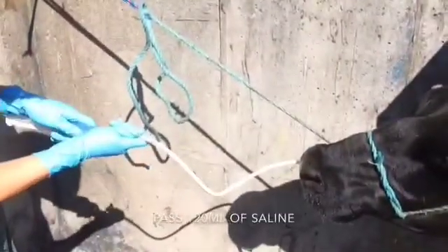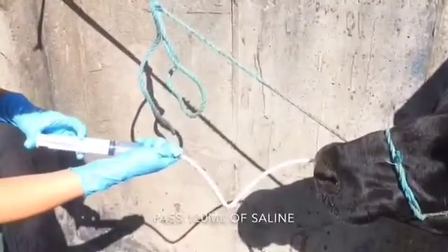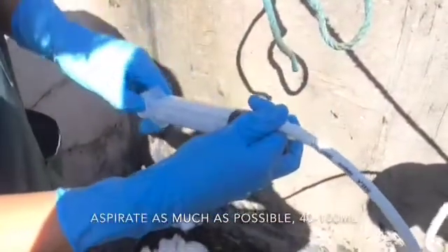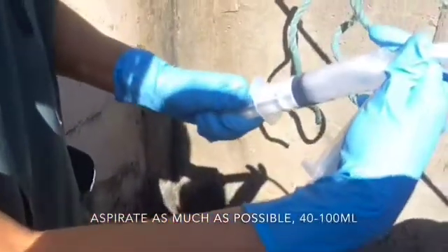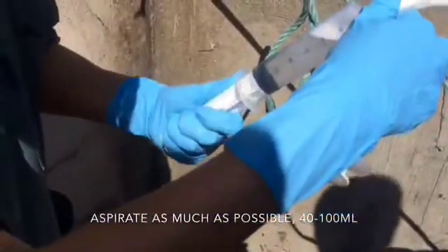120 mils of saline is then passed down the tube into the alveoli. This is then aspirated — as much as possible. You will notice it's slightly cloudy, and sometimes you'll see some debris, or possibly even lungworm larvae, if that is the case.